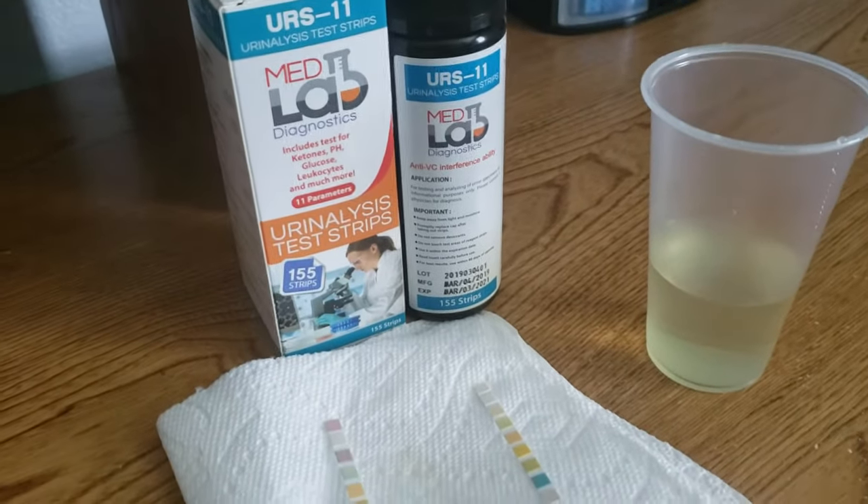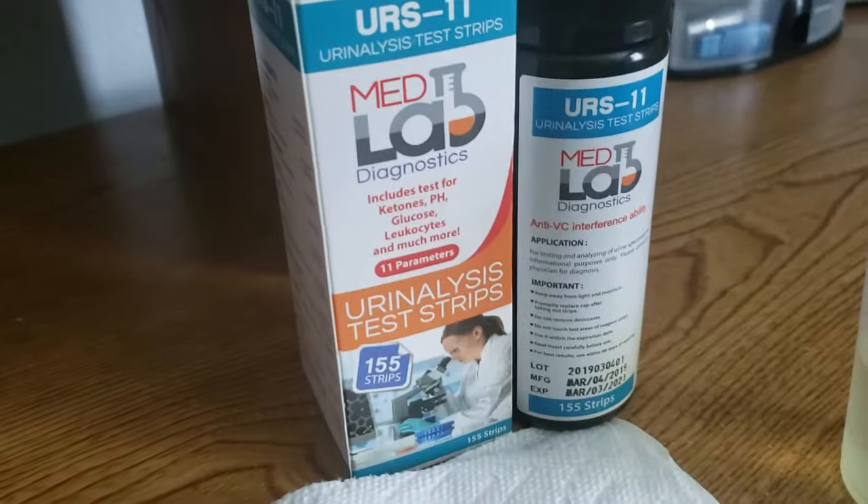Hello, this is Elena with MedLab Diagnostics doing a quick video on how to use your 11-parameter urine test strips.